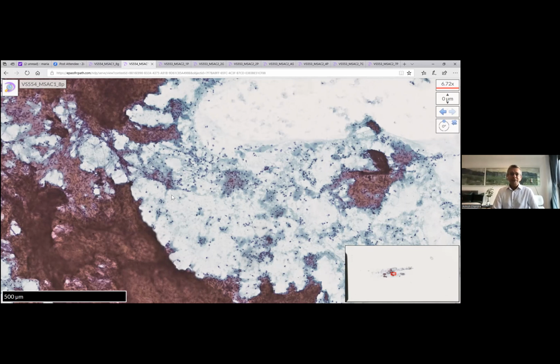So yeah, spotting necrosis can be a bit of a challenge, I agree. Caseous necrosis is very thick, amorphous, granular material, which is a hallmark of TB. And if it is there in abundance, you will see it, you will recognize it. I don't think you need to be looking in a test situation for a focus of necrosis. If we're going to put out a case of TB, there will be at least recognizable amounts of necrosis there for you to be able to find it.